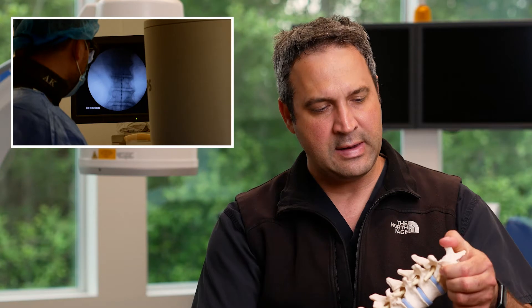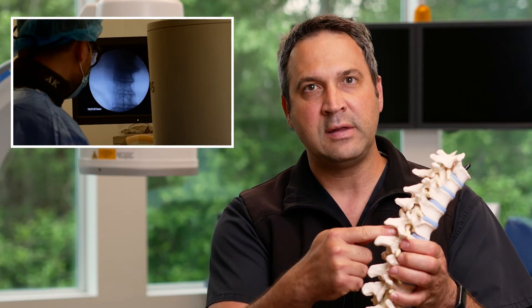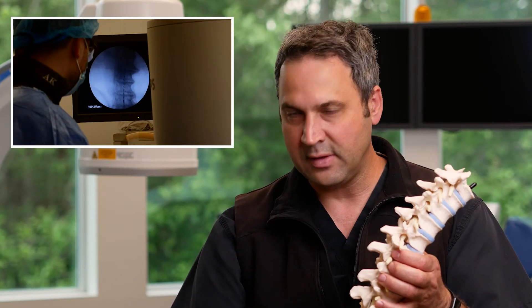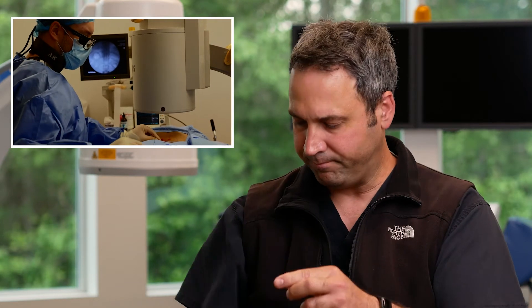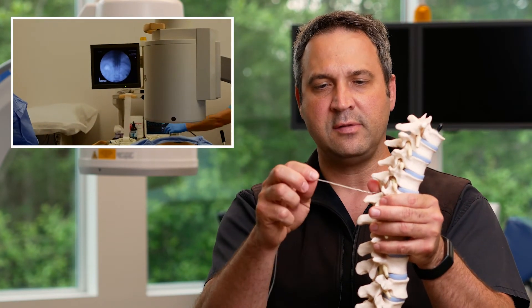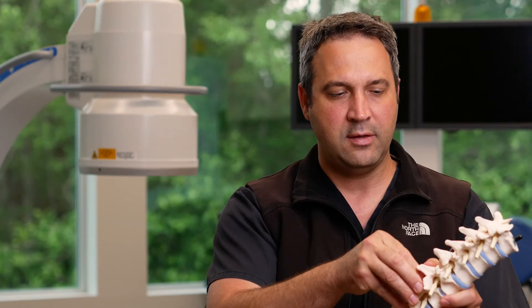With the trial phase, what I'm doing is basically placing needles in the epidural space. Under x-ray guidance, I'll place a needle down next to the spinal cord — not into the spinal cord, but on the outside in the epidural space — and I thread these leads almost like a fishing line into the needle. Once they're in place, the needle comes out and you're left with these leads just on the outside of your skin, which we tape on the outside of your back.